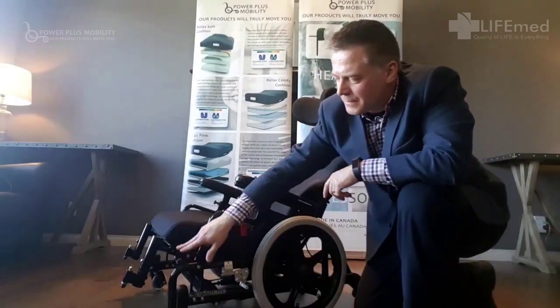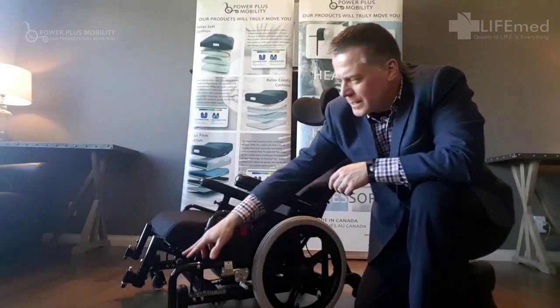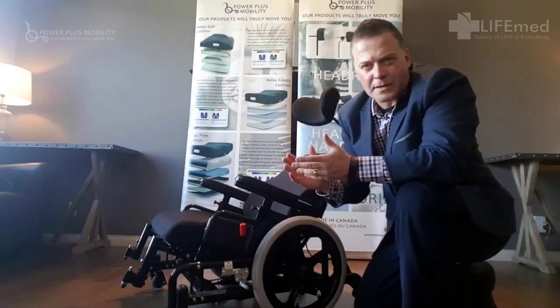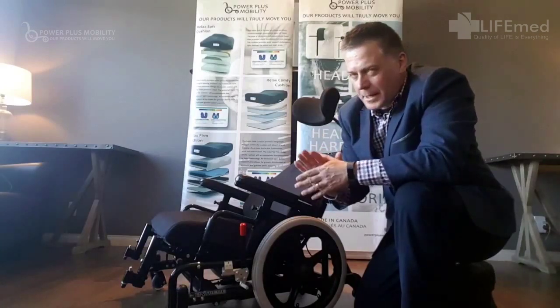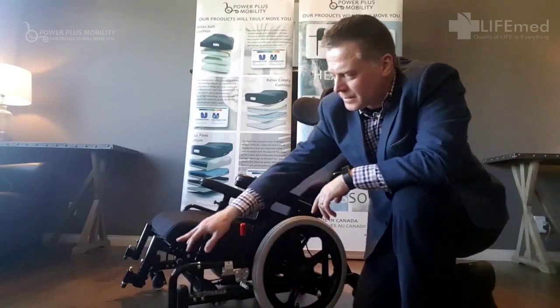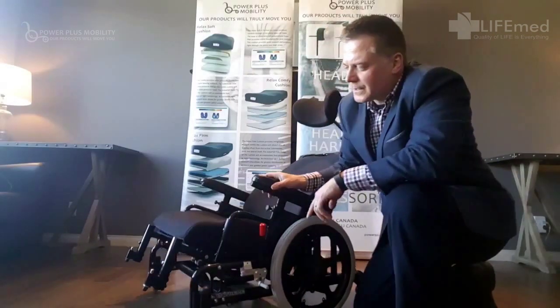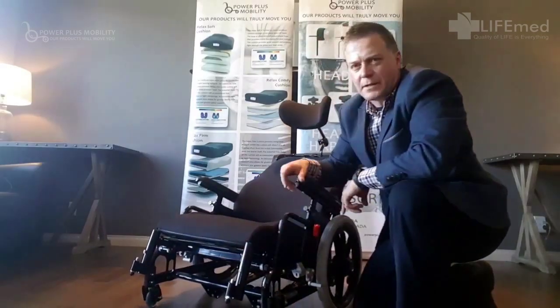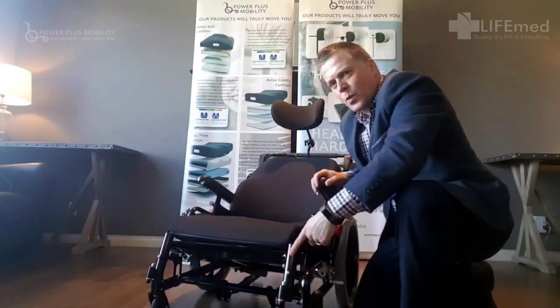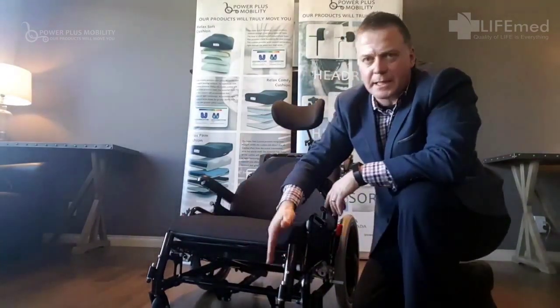Here's the extra pivot point that allows us to get that extreme low seat-to-floor height. We could raise it up a little bit higher, which would raise our seat-to-floor height but also give us more tilt if we needed it. But in most cases we're going to have it in this low position, and with our smallest caster and wheel configuration we've got an eleven and a half inch seat-to-floor height. We've even flared the housing here for the footrest, so the client is going to have more room in this area to foot propel without hitting any of the hardware.